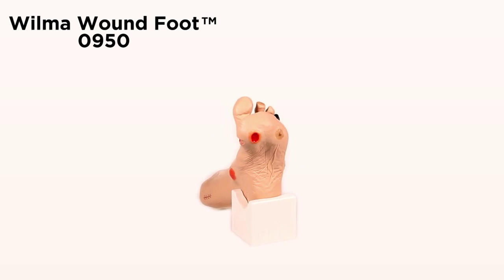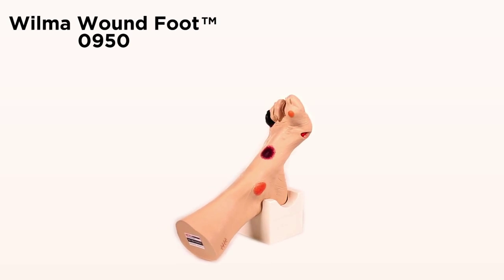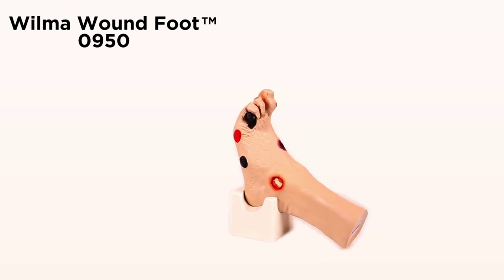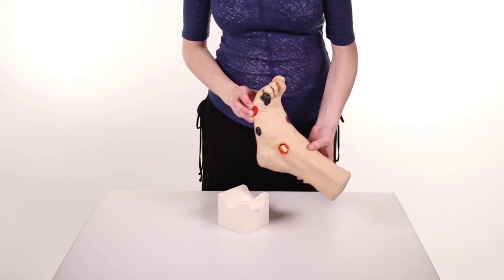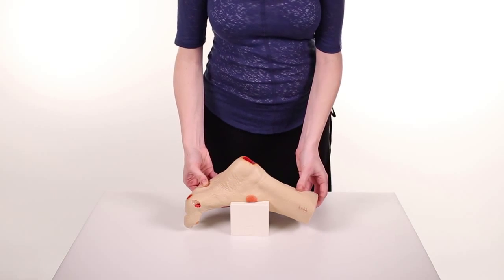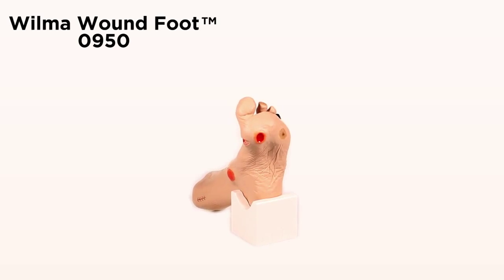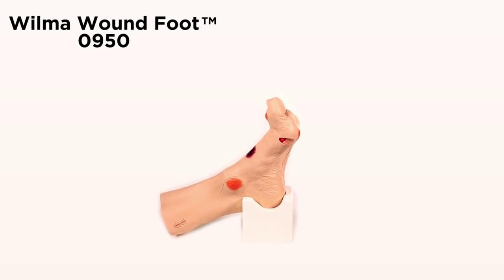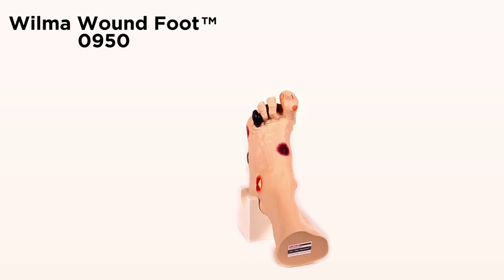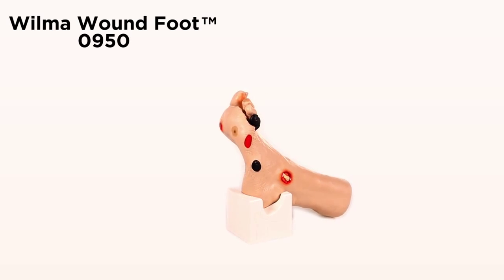This is a great model to show staff, patients, and their families the various conditions present and stress the importance of proper foot care to avoid acquiring one of these conditions. This model comes with a unique stand for presentation — you can set the model in the stand to keep your hands free. Great care has been taken to color each wound just as you would see it on a patient. A great tool for identifying the various conditions, competency testing, and skills assessment for healthcare professionals.